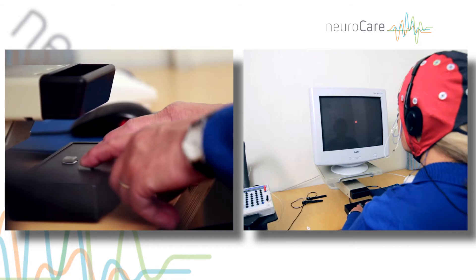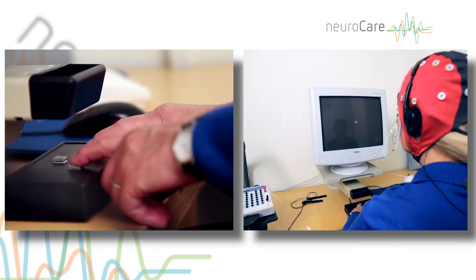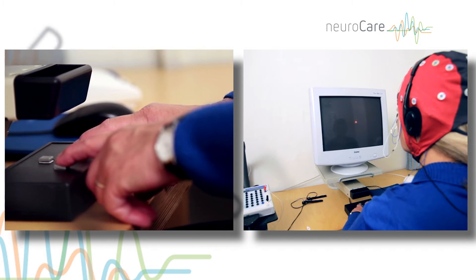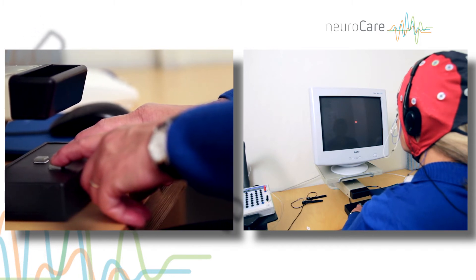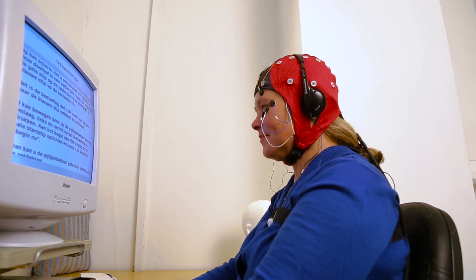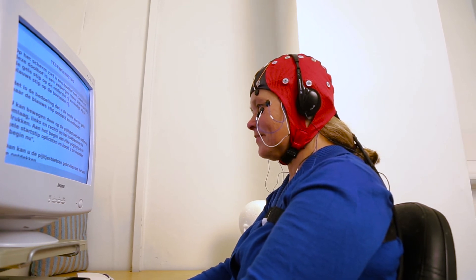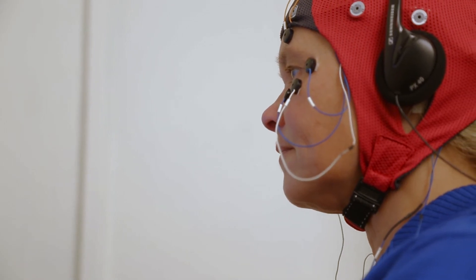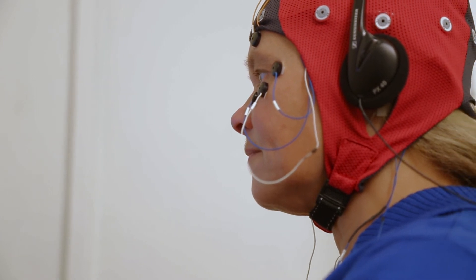For different tests, the client receives instructions via the computer screen and headphones. The whole QEEG assessment takes about an hour, and the client is asked to complete several tests using a button box. During the assessment, it is very important that the client remain relaxed and comfortable, as muscle activity and stress can interfere with the EEG signal.